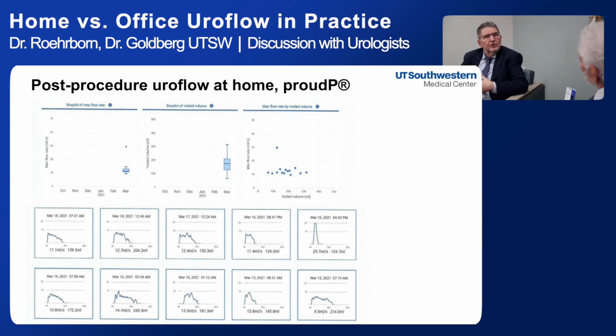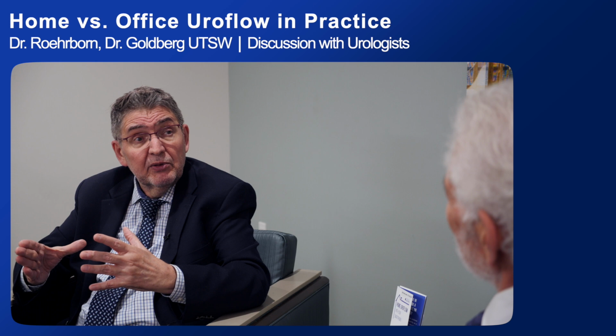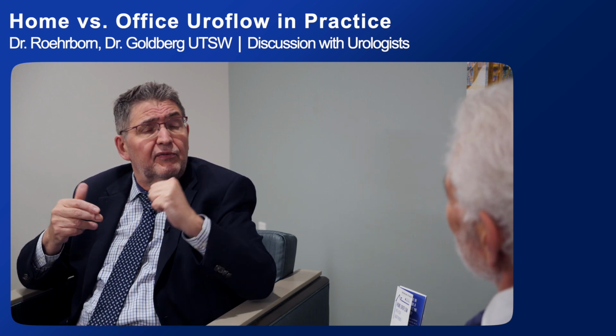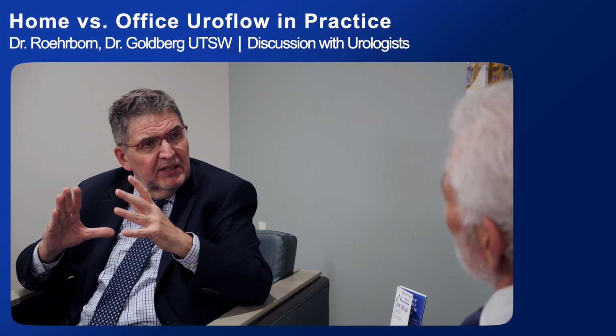Right. So, to play this out a little bit, here's the example of his flow rates at home, quite a bit better and reproducible. Really interesting. So multiple flow rates at home, reproducible, good volumes. We take the average, we say, you're okay. The single flow rate in the office, we say, that didn't work out okay, you're still not really good. So it makes a big difference because we base decisions on that.